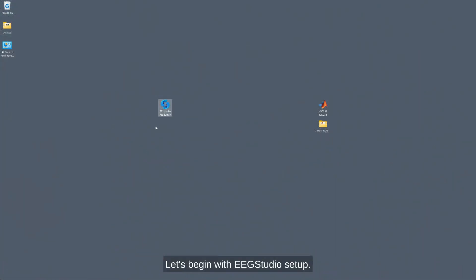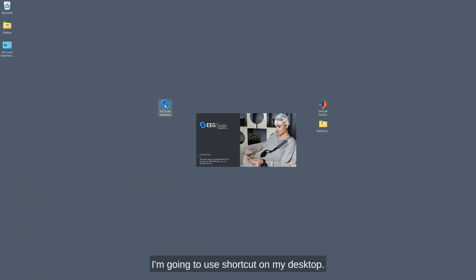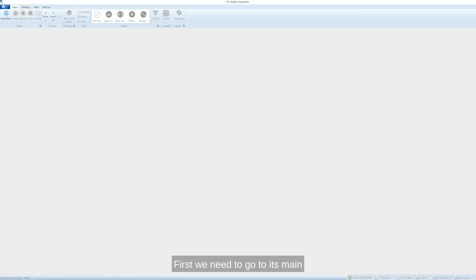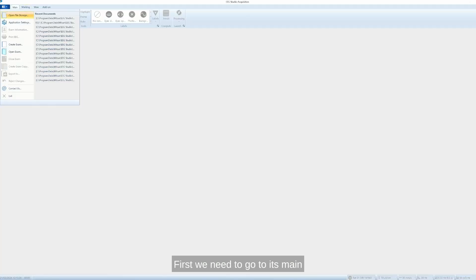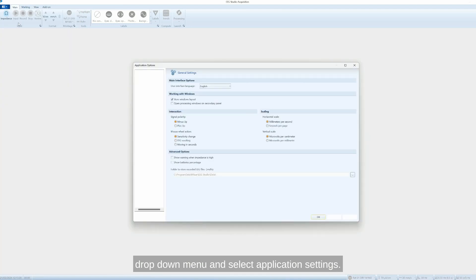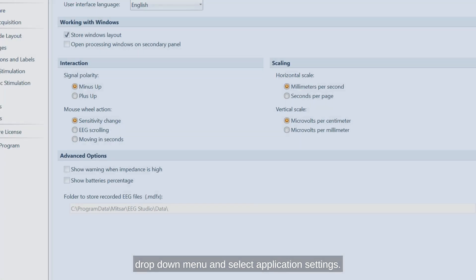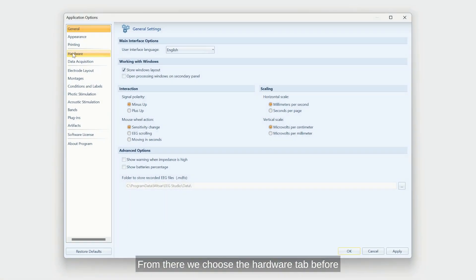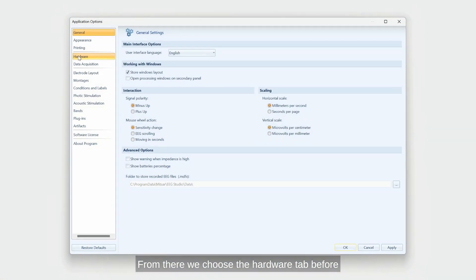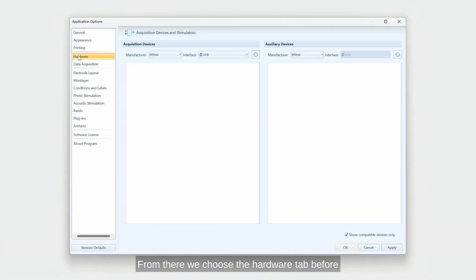Let's begin with EEG Studio setup. Start its acquisition module. I'm going to use shortcut on my desktop. We need to go to its main drop-down menu and select application settings. From there, we choose the hardware tab.